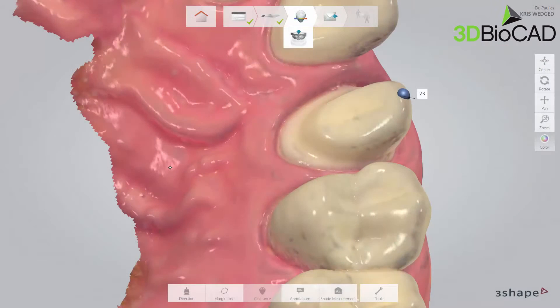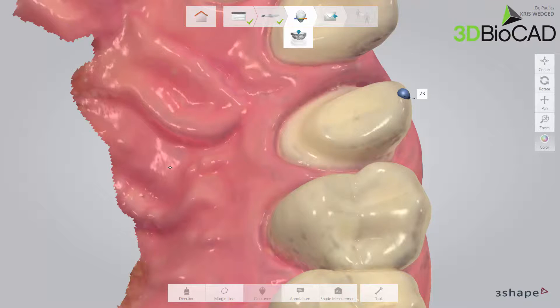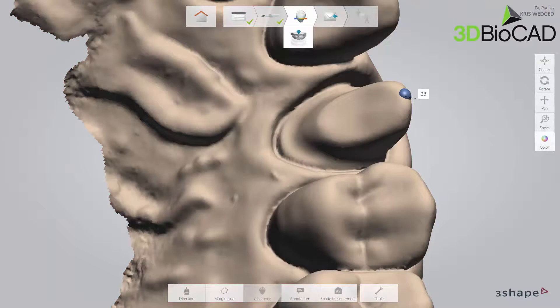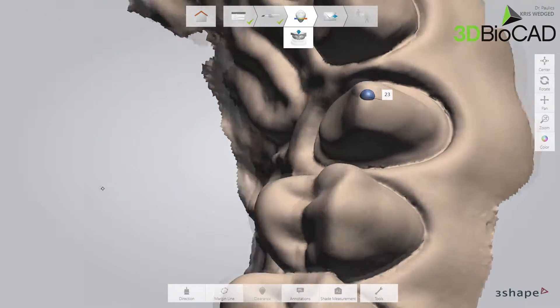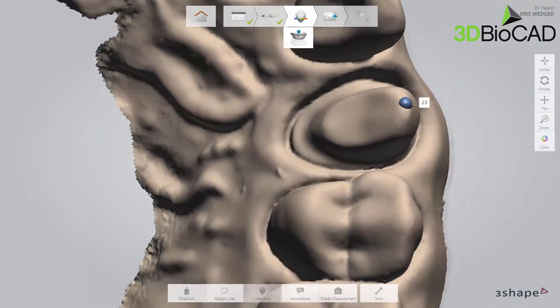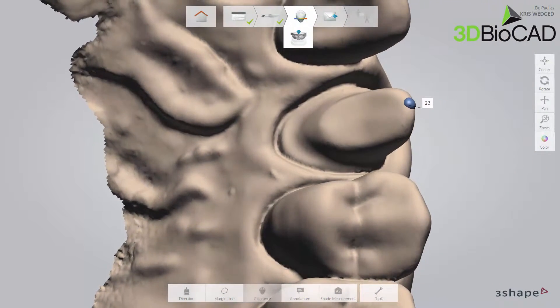So what does post-processing do? What you see on the scan page is actually a preview. It is designed to give you real-time feedback to guide you through the scanning process. However, as time for processing during scanning is limited, the level of detail is also limited.